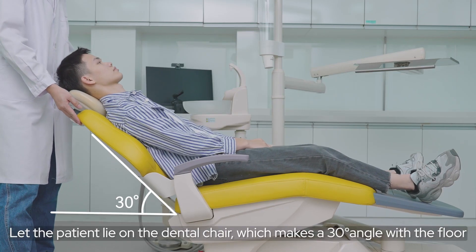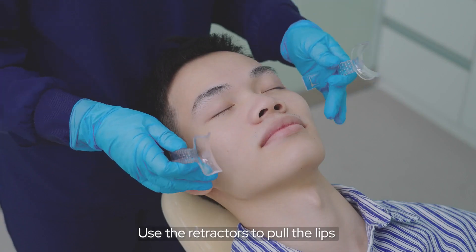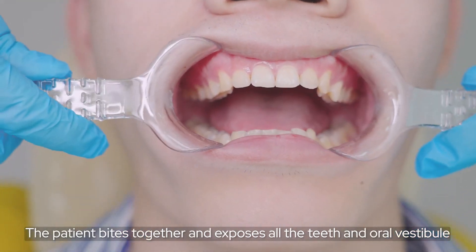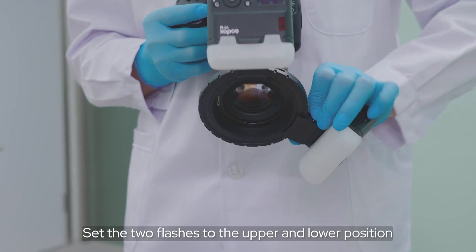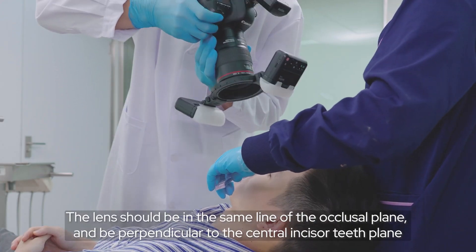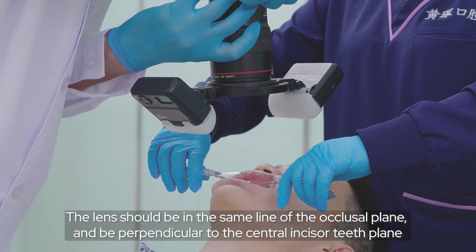Let the patient lie on the dental chair at a 30-degree angle with the floor. Use the retractor to pull the lips. The patient bites together to expose all the teeth and oral vestibule. Adjust the line position on the ring and set the flash to the upper and lower position. The lens should be in the same line as the occlusal plane and perpendicular to the central incisor teeth plane.